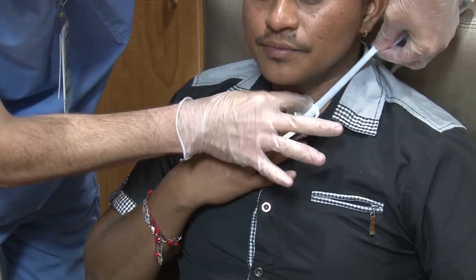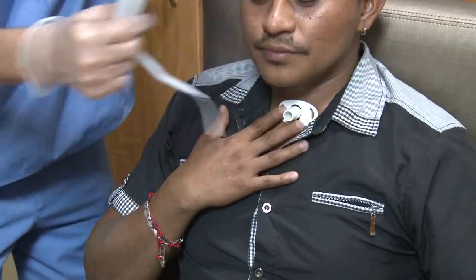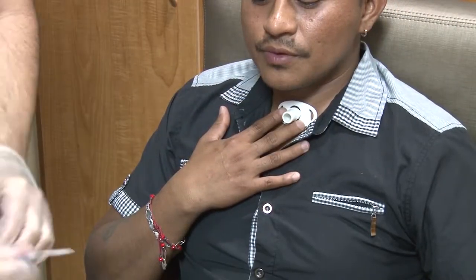With your finger on the neck plate, take off the old neckband. After taking off the old neckband, pick up the new neckband.